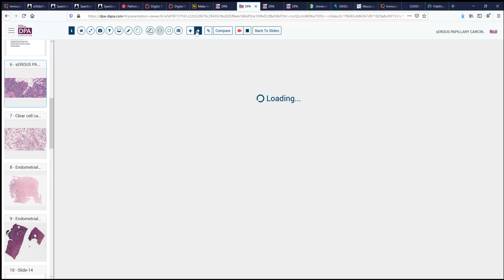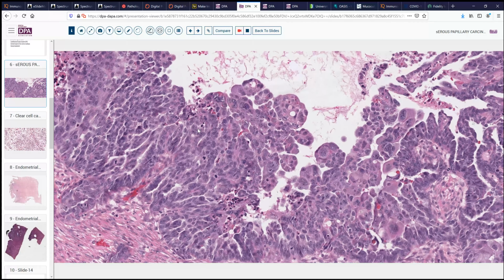So just as a matter of review, let's take a look at this serous carcinoma. Now this can look in many instances like endometrial adenocarcinoma of the usual type. It can have nice glandular formations and some solid areas and so forth. The things that should tip us off to make us be concerned are the presence of high-grade nuclei, such as you see here, and the presence of micropapillary structures such as this. These are hallmarks that would say, I'm not usual endometrioid carcinoma, think about serous. And then, of course, once you've had that thought, you'll probably want to do a p53 immunoperoxidase stain or some other mechanism to establish mutation status that will help you to reliably make that diagnosis.